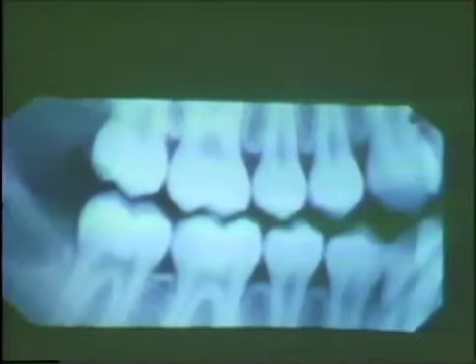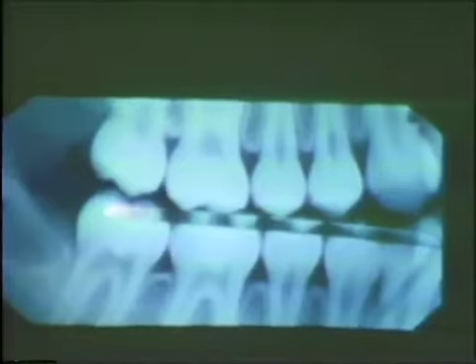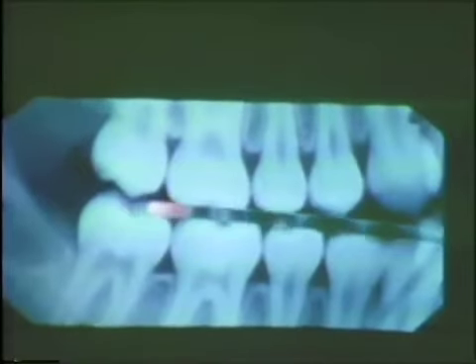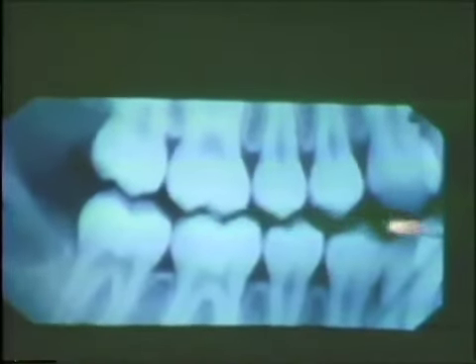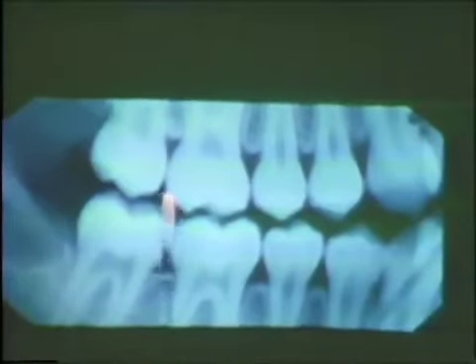This excellent interproximal radiograph illustrates a number of features that are desirable in a successful bite wing film. First of all, the occlusal plane of the teeth virtually splits the middle of the radiograph horizontally, providing adequate coverage of both upper and lower teeth. The maxillary contacts are open, giving excellent views of all proximal surfaces. The extent and character of the interseptal alveolar bone is also well displayed.